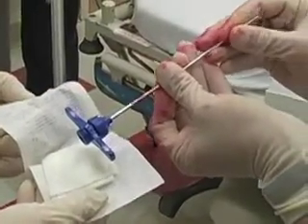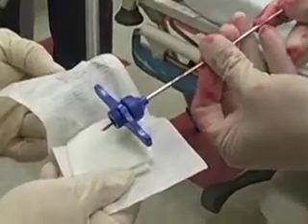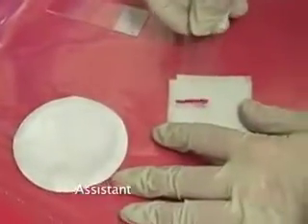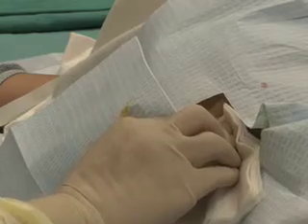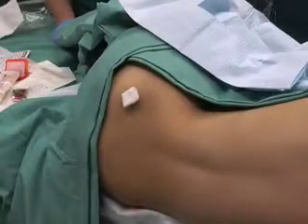Remove the specimen from the needle by inserting a sterile probe into the distal end of the needle and push the specimen through the hub onto sterile gauze or a slide. Inspect the specimen for adequacy of marrow. Apply pressure to the biopsy site with gauze until any bleeding stops, and cover with a bandage or pressure dressing.